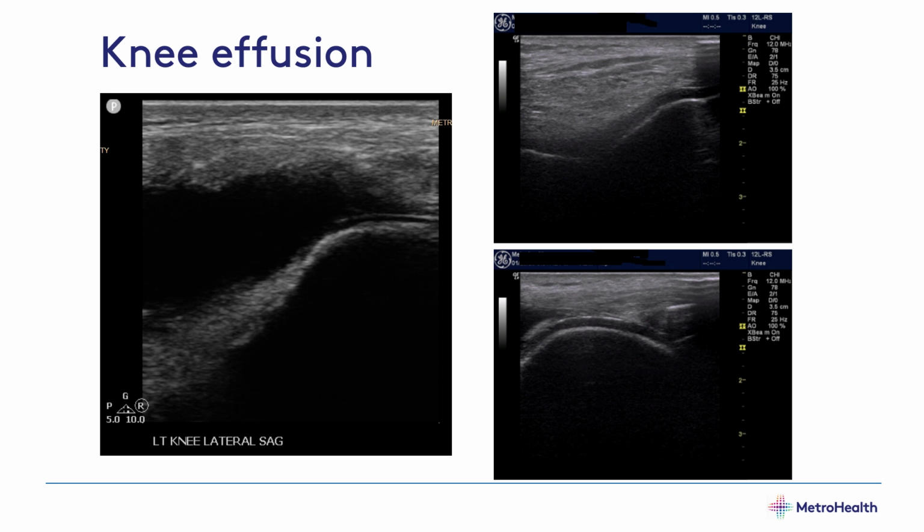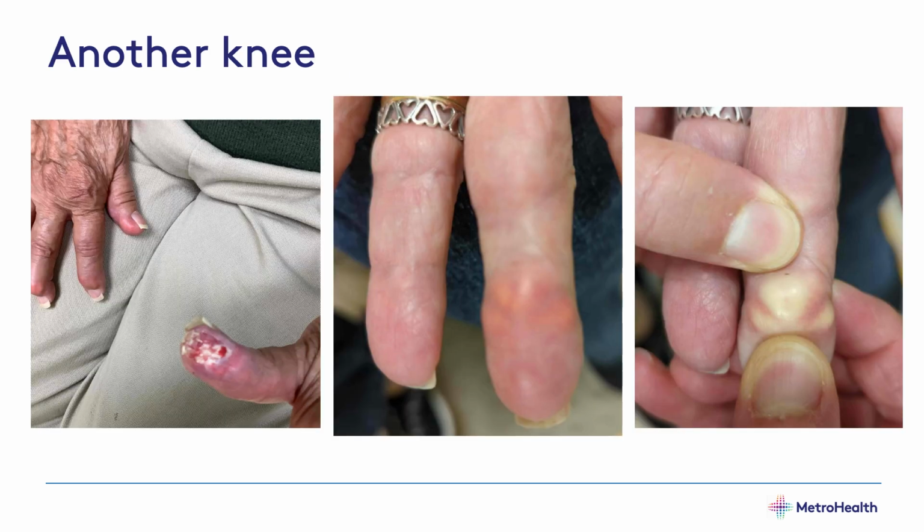So I did it lengthwise over the lateral femoral condyle, and now you see a pretty decent double contour sign. In fact, I would submit that this might be the same part that you guys looked at in the ED. In this case, this sort of beaded appearance of that double contour sign is felt by the experts to be a really good double contour sign.